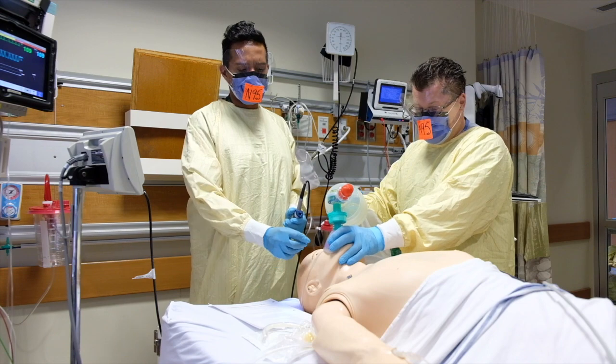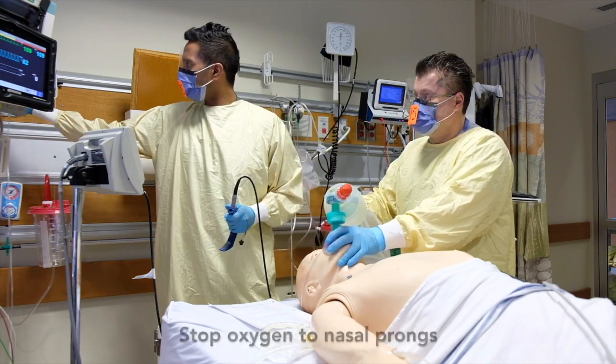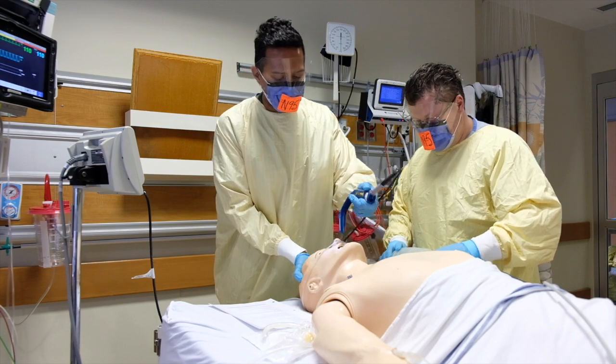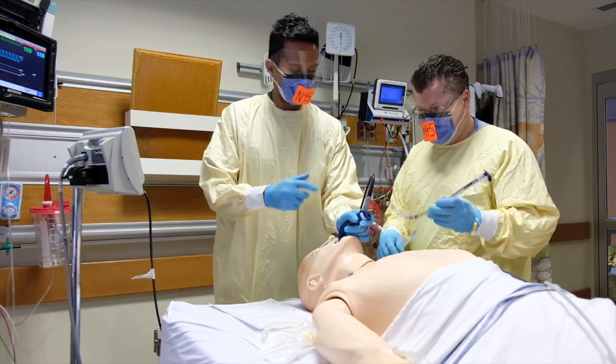The first thing we'll do, just so that we don't have pressure buildup underneath the mask, is we'll stop the oxygen in the nasal prongs. And after that, we'll take the bag valve mask off, and I will proceed with intubating.